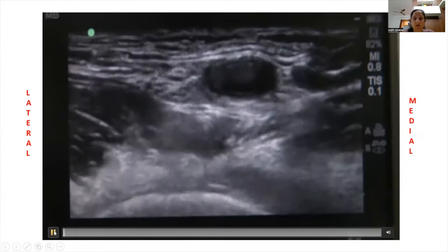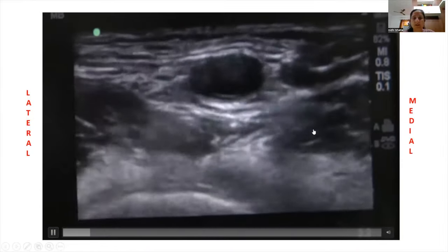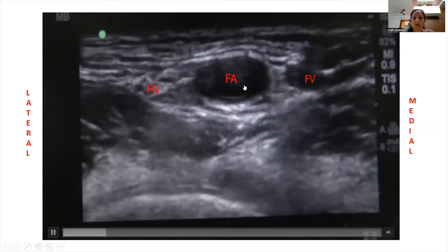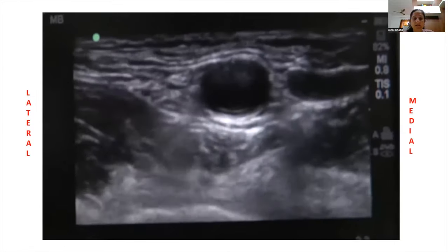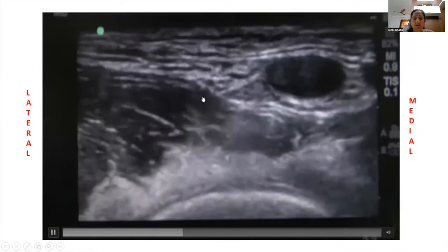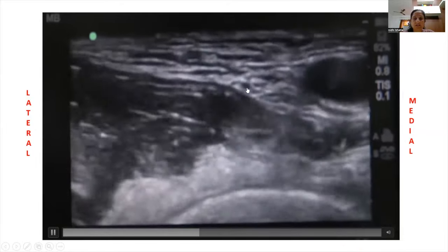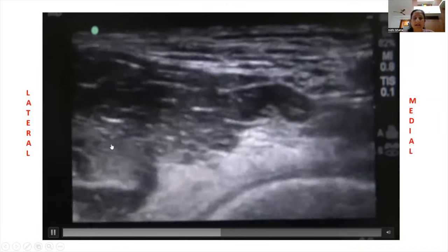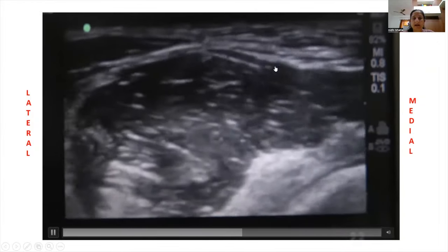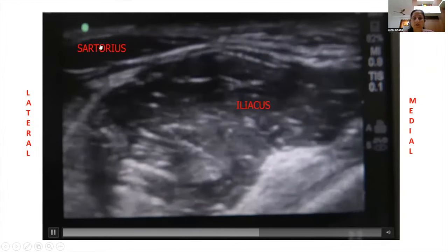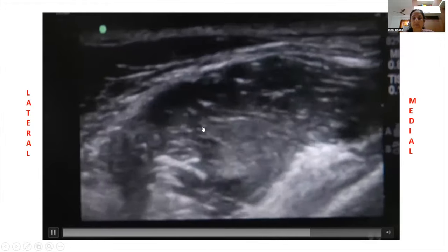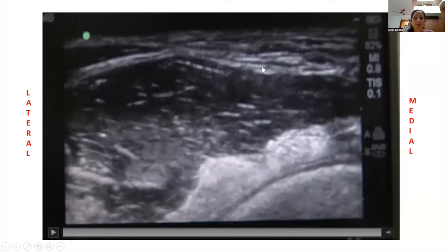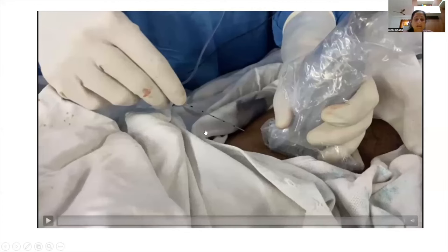Here is a video showing the infrainguinal fascia iliaca compartment block technique. The probe is placed transversely just below the inguinal crease. You can see the femoral vein, the pulsatile femoral artery, and lateral to that the femoral nerve. Moving the probe laterally reveals the large belly of the iliopsoas muscle, the sartorius muscle above it, and the fascia iliaca plane — our area of interest where the drug is deposited.